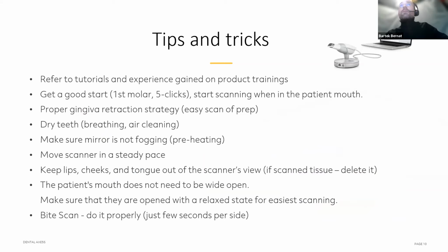So yeah. Okay, so once you saw some scanning myself, just a bit of it, I have a few tips and tricks about that. So basically, we strongly advise you to refer to some tutorials and gain some experience on that. There's plenty of the materials on the YouTube, on the webinars like that, so you can get some information and practice also on your own.